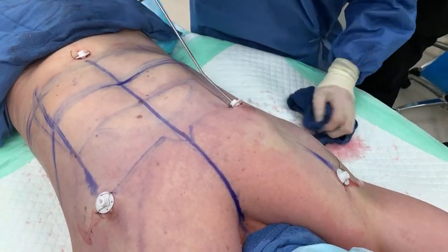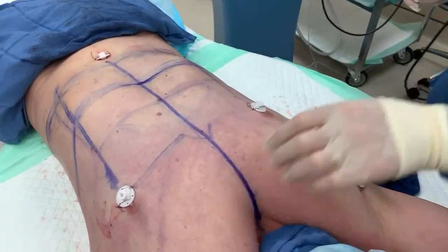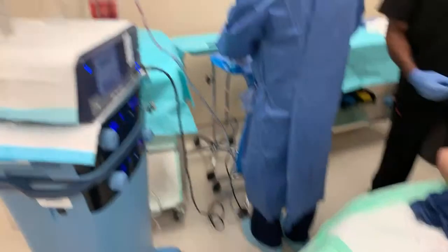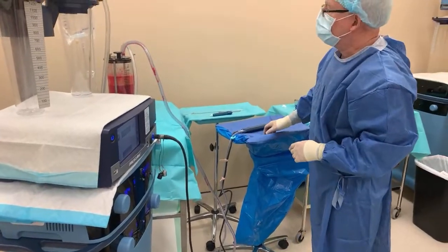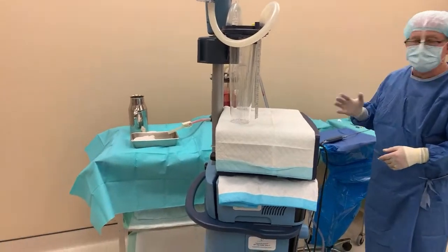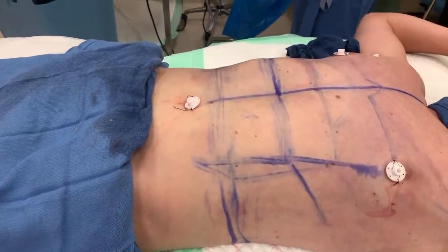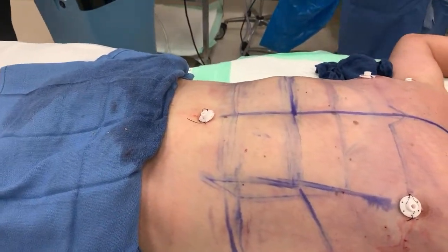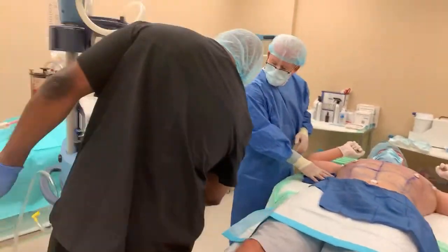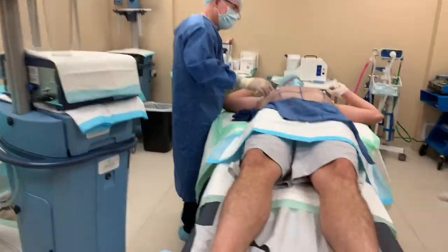What's the recovery like? How much is the surgery and what is he feeling? Recovery — this patient is going back to work tomorrow. Depending on what you do, you shouldn't be doing any heavy lifting, but you could go back to work the next day. Now look down — look at the six-pack. You're a little swollen there from the local, but I may whittle that down a little bit. I kind of like it.